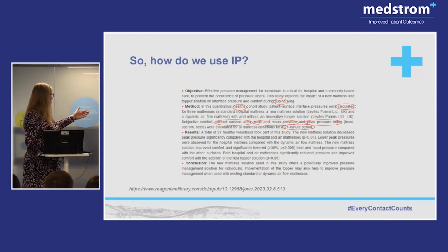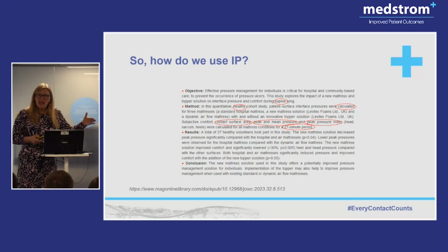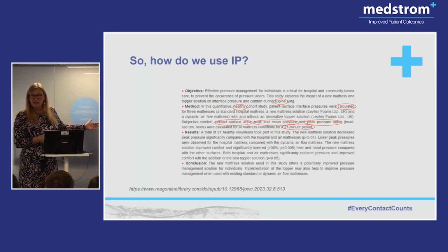I genuinely don't know, and to be honest, I didn't read the rest of the paper. I just thought there was a good abstract to choose. My supposition is, a long time ago when I was doing that work, we were relying on some very old sleep studies. Some of you remember a really old yellow mattress that had a 7.5 minute cycle, not the 10 minutes we have today. That cycle time came from sleep studies about how often average people move in sleep. So my only supposition is that's 3 sevens. But I don't know.